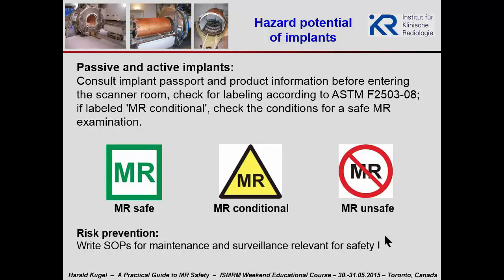Final remark, how to go to work with implants, passive and active implants. If a patient comes with an implant, consult the implant passport and the product information before entering the scanner room, and check for the labeling according to the ASTM standard. If an implant is labeled conditional, then still do not allow the patient to enter the scanner room. Check the conditions for a safe MR examination first.